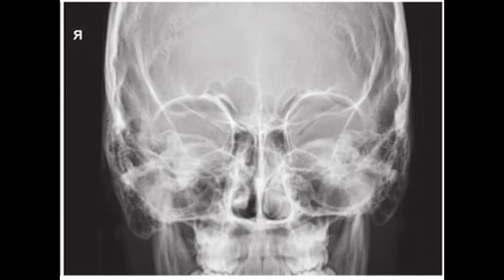So that's great. And then the 15 degrees that we put on the board cause the petrous ridges to be projected as lying in the lower third of the orbits. So this image looks great.